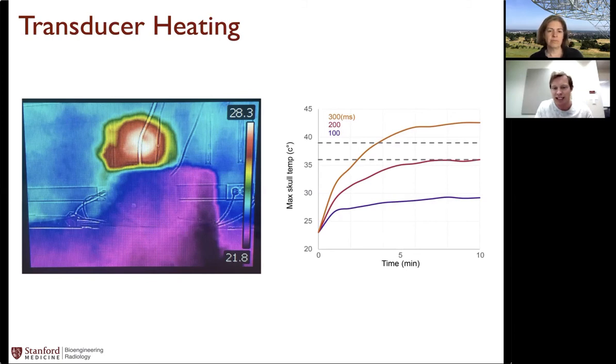And I basically just tried different pulse widths. So here on the right-hand side, you can see I tried 300, 200, and 100 millisecond pulses at 1 hertz. So basically like 30% duty cycle, 20%, and so on. And I just looked at what happened to the temperature of the skull over time. And you can see that after 10 minutes of passing this alternating current, if it was at 30% duty cycle, or 300 milliseconds, that temperature actually rose to around 37 or 38 degrees Celsius. So that's above the physiological normal range of the brain temperature. And yeah, we're only going a degree or two above that range, but that could be like inducing a fever, and that could be problematic. And again, this is at 30% duty cycle.